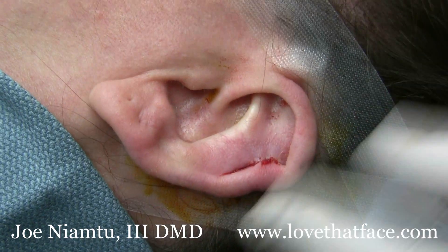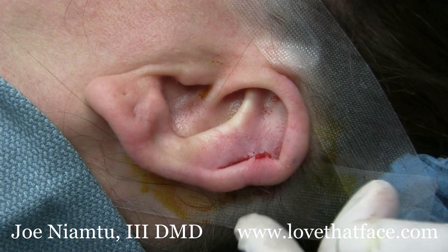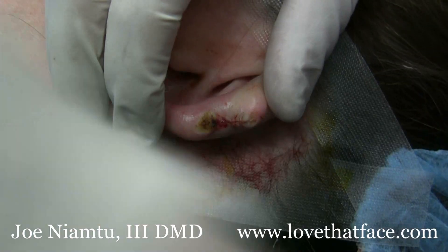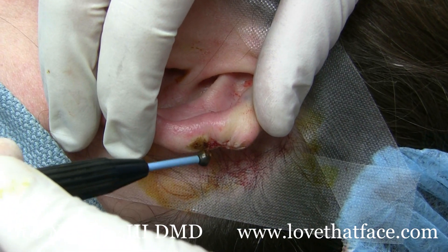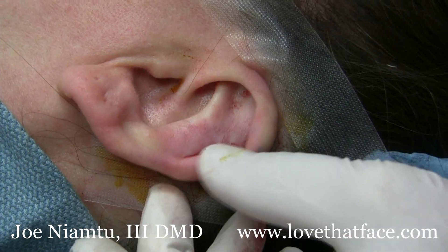Here we are post removal immediately — we've just undermined that and got primary closure. On the posterior we did the same thing. This little burn here — we had a little protuberance, a little dog ear, and we used the Elman ball electrode to smooth that down.